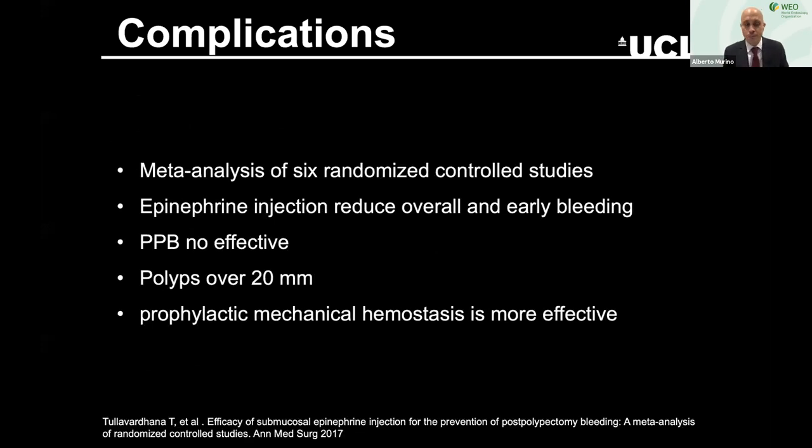A meta-analysis performed from 6 randomized controlled studies showed that epinephrine injection reduced the overall and early bleeding, but for post-polypectomy bleeding, epinephrine injection alone is not enough. In fact, it has the same result as a saline injection. And for polyps over 20 millimeters, prophylactic mechanical hemostasis, so with endoloop or clipping, is more effective. I think we can discuss this during the discussion, but there is a lot of contradiction again.